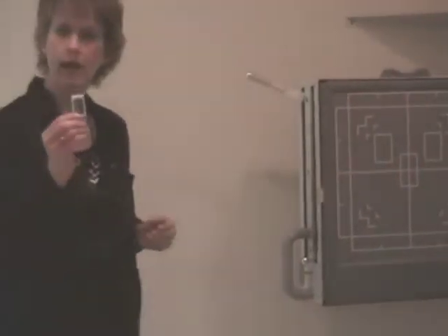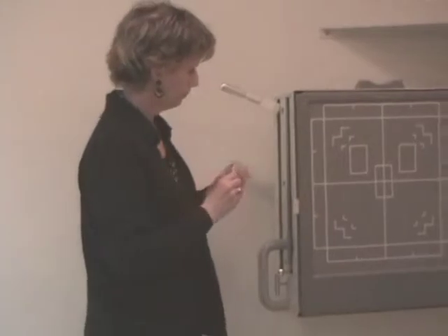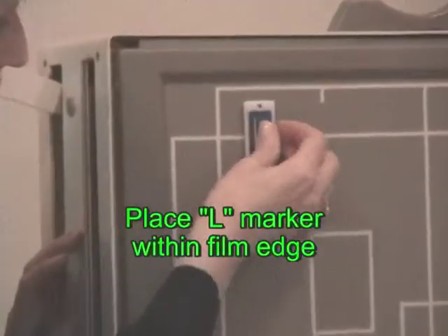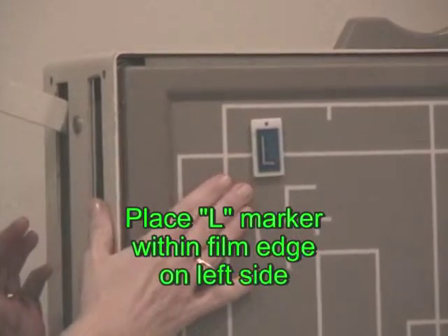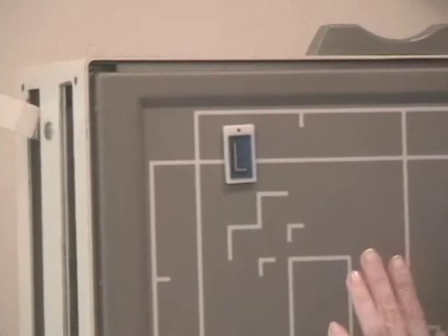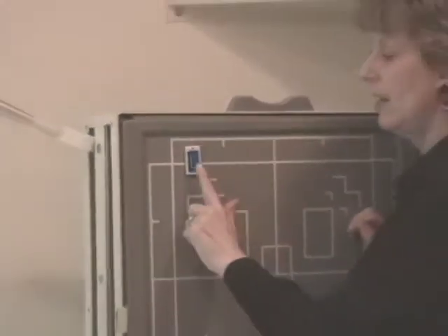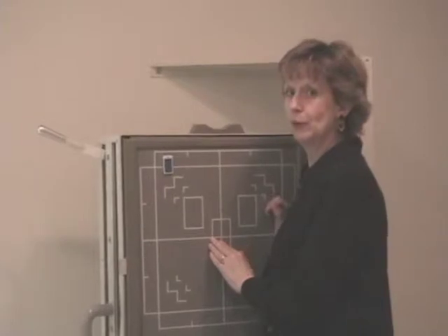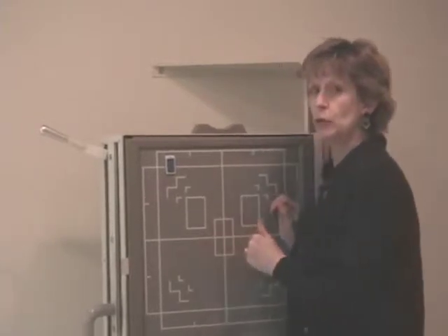I will get my L or my R marker now, and I'm going to put it just within the film's edge on the left side. The patient will be facing the wall bucky like this, and then the left marker will match up with the patient's left shoulder. That ends the room prep.